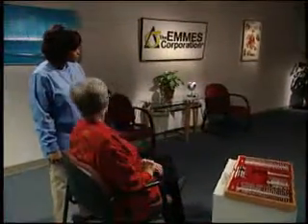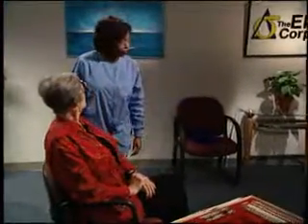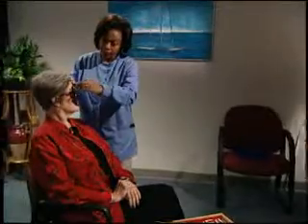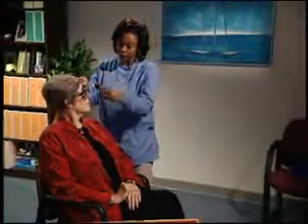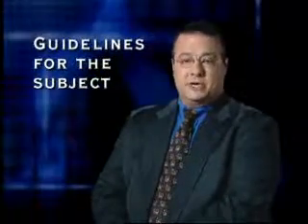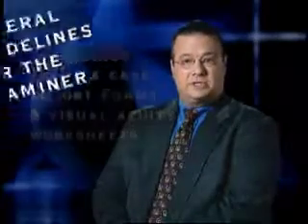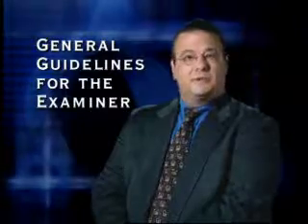While some studies measure visual acuity at shorter distances, this video will focus on beginning all vision testing at a distance of 4 meters. All testing, whether distance or near, begins with the right eye, making certain that the fellow eye is adequately occluded. There are 3 sets of guidelines to consider when testing visual acuity: guidelines for the subject, guidelines for the case report forms and the visual acuity worksheets, and general guidelines for the examiner. We will begin with the guidelines for the subject.